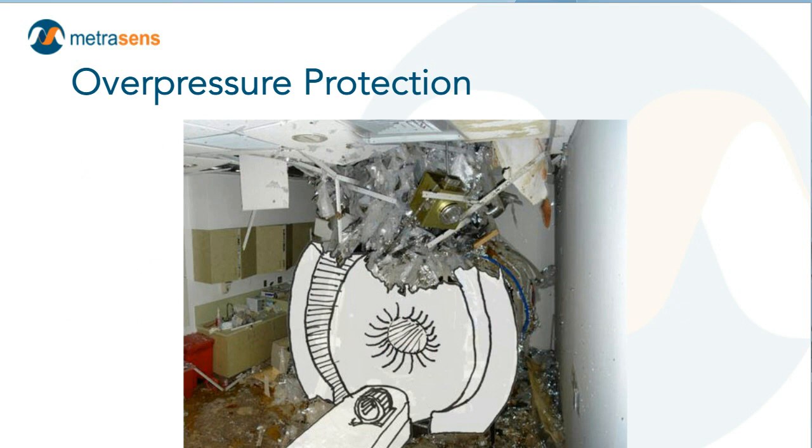Now, this is an image, and I've blotted out the details that would indicate the MRI manufacturer, because that's really not important. This risk is consistent across different MRI vendors, different MRI systems, where there's enough cryogenic material on board that requires a quench pipe. What happened in this instance is, remember that quench pipe discharge detail that prevents horizontally driven rain? Well, this site had one that looked very much like what I was advising you not to do.